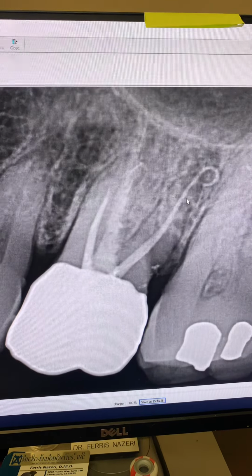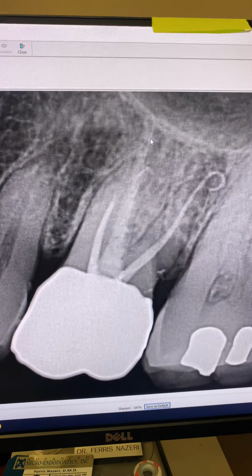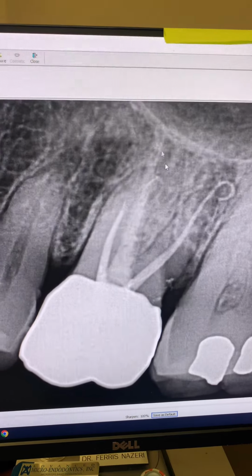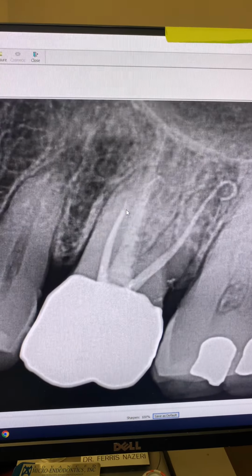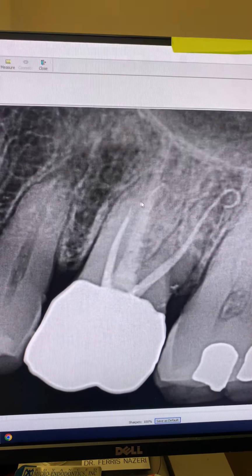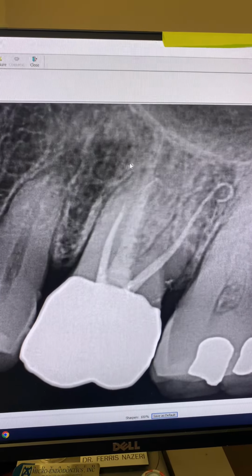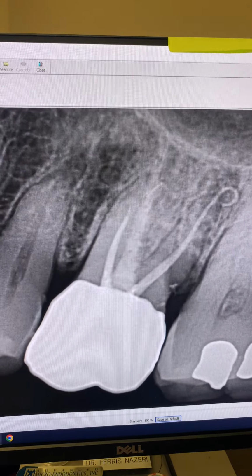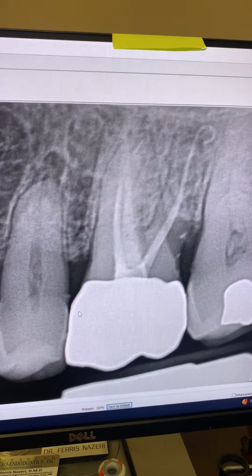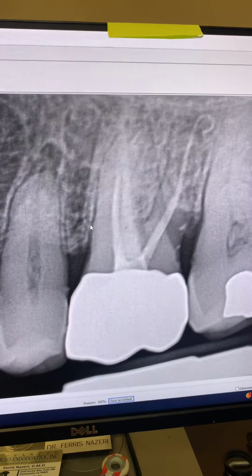Dr. Lin is one of those studies. Dr. Lin, author. If my MTA was short, it didn't affect the outcome. We can see the large periapical lucency healed completely. My under-obturation didn't cause endodontic failure. As a matter of fact, the periapical lucency that was associated with the MB root healed completely. I did this root canal in one appointment. As you can see, one appointment endodontic treatment works.